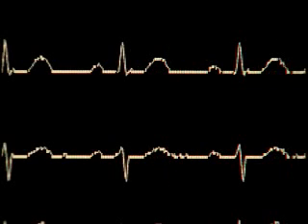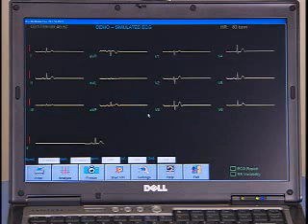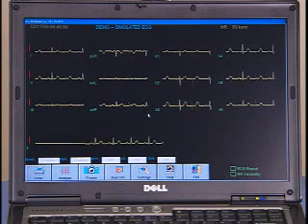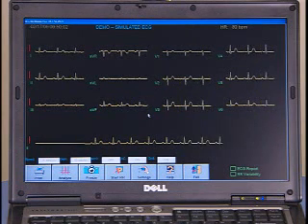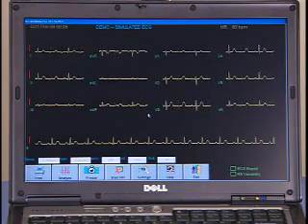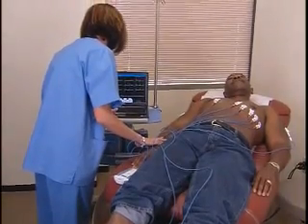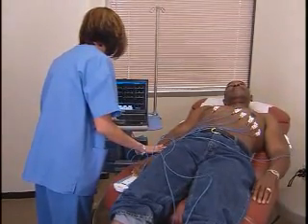This display indicates the overall rhythm of the heart and shows if the electrical activity is normal or slow, fast or irregular. The other piece of information an ECG provides is measurement of the amount of electrical activity passing through the heart. The doctor can assess with this measurement if parts of the heart are overworked or too large.